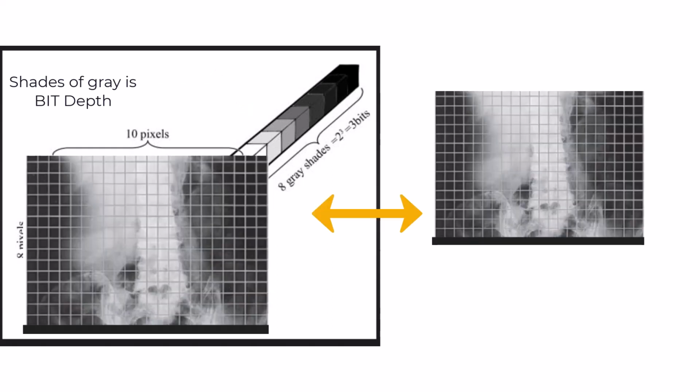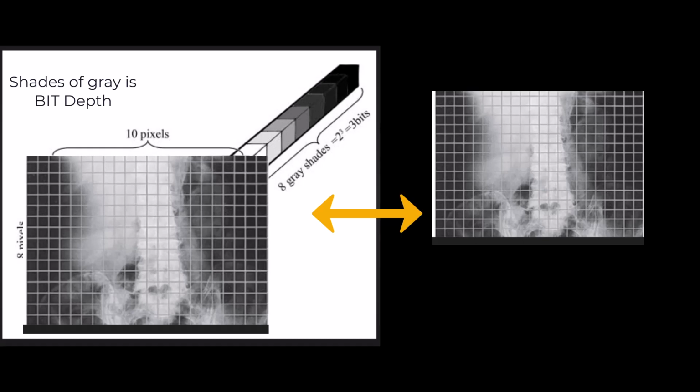So we've got our matrix where we're going to map to, and we've got the shades of gray that we're going to map. How would we do that? We do that by the intensity. And this is where we map the intensities or frequencies.